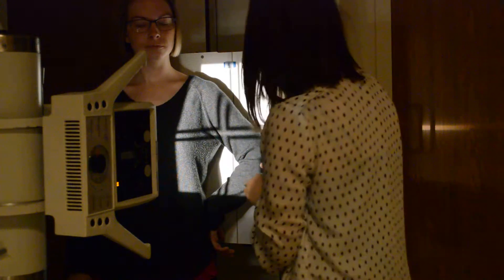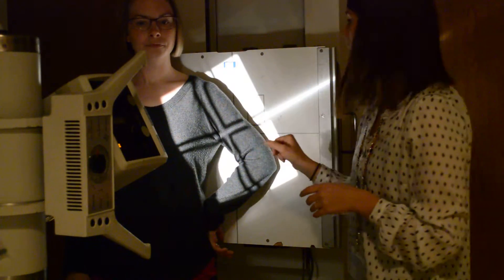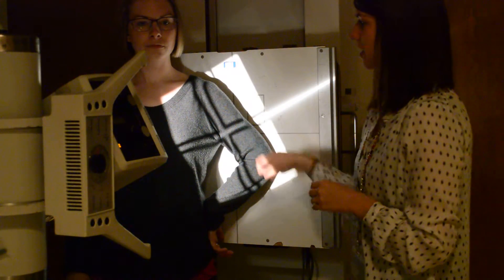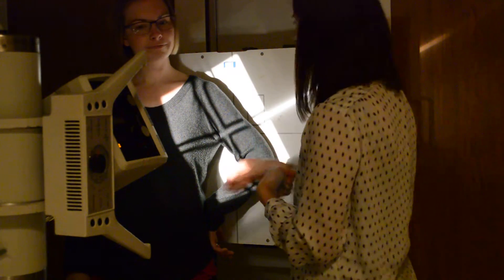We can then oblique her body a little bit to reduce OID at the head of the humerus. You want to make sure you have light above. You can turn your tube head — light above the head of the humerus. I've got my epicondyles set. You would measure through your central ray for this. If you wanted to do this as an alternative in the PA, we'll just switch and do her right.